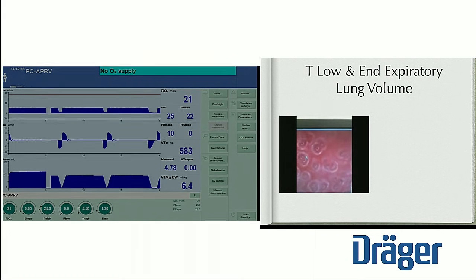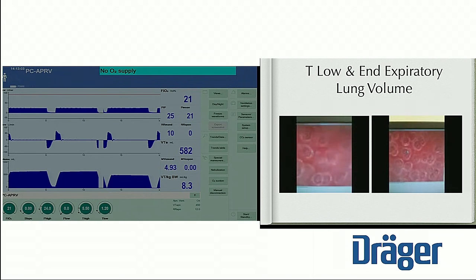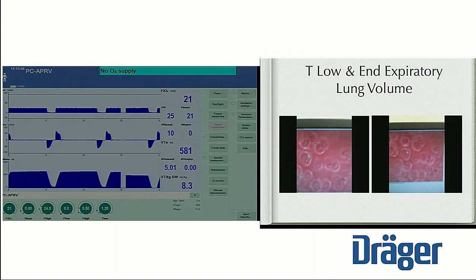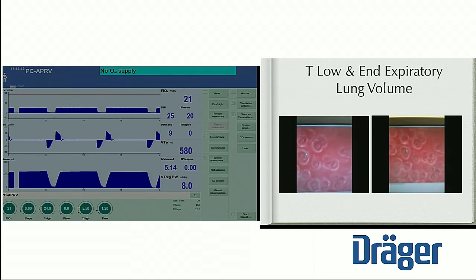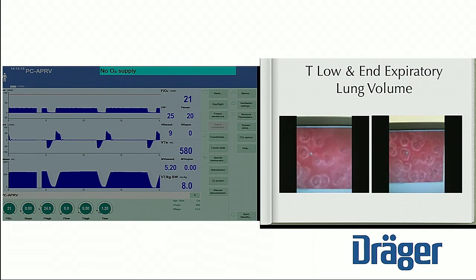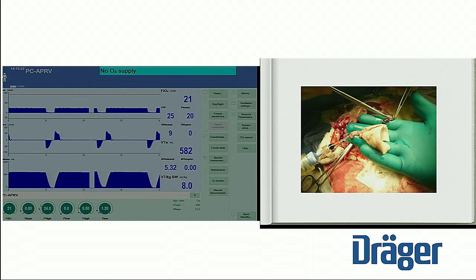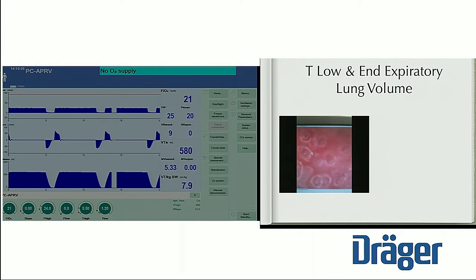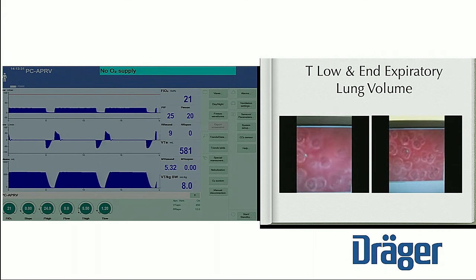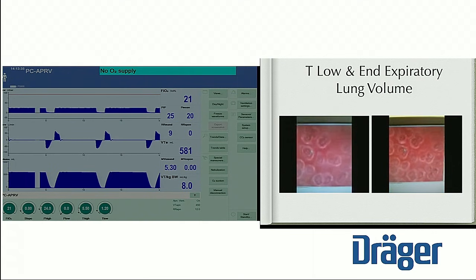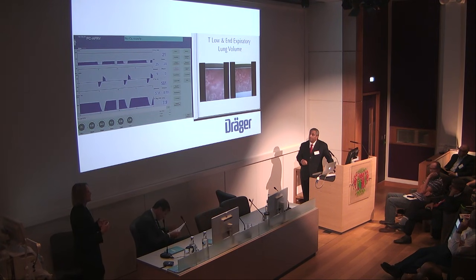If you set it correctly — this is an injured lung model with tween and high tidal volume lung injury — the lung is very stable once you go back to 75%. This is acute lung injury, not obstructive lung disease; this is how you'd set it for acute lung injury, ARDS, or someone with the potential for that. What prompted this in vivo microscopy was reading an article titled 'APRV had the highest work of breathing,' and the reason was because the T-lows were set so extraordinarily long — we duplicated the study, and at 1.2 seconds the flow goes all the way to zero, meaning the lung is collapsing.